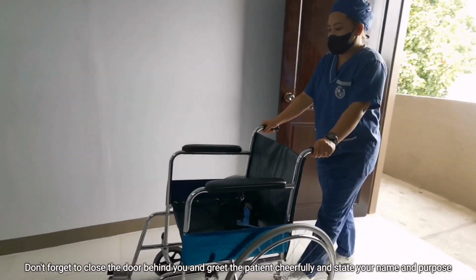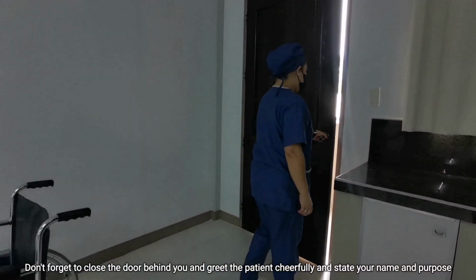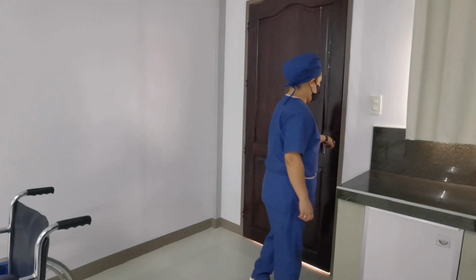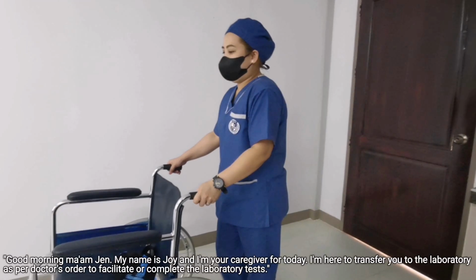Don't forget to close the door behind you and greet the patient cheerfully and state your name and purpose. Good morning, Ma'am Jen. My name is Joy and I'm your caregiver for today. I'm here to transfer you to the laboratory as per doctor's order to facilitate or complete the laboratory tests.